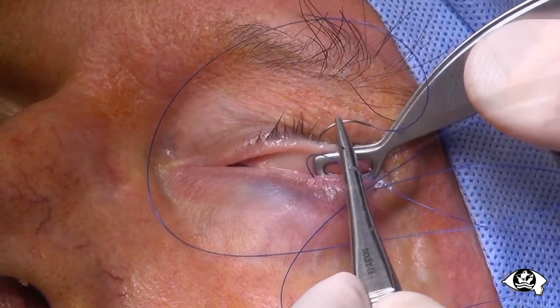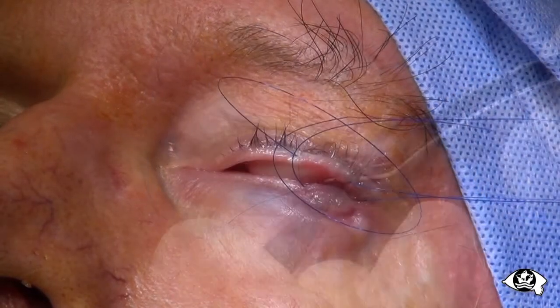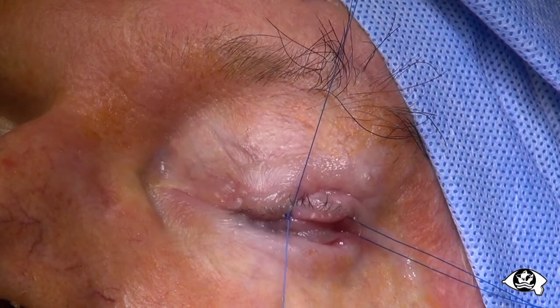A second bite with the same suture in the opposing lid margin creates a strong suture tarsorrhaphy which can hold for several weeks. This renders temporary surgical tarsorrhaphy obsolete.